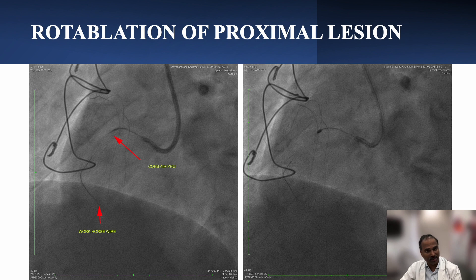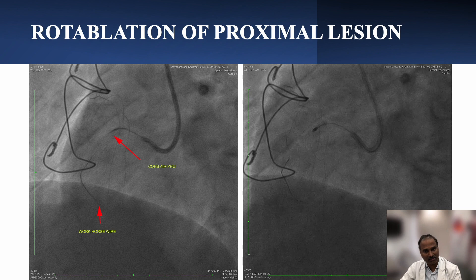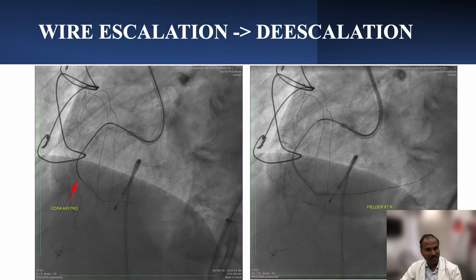We decided to go ahead with ablation of this lesion — a sequential ablation approach: first ablate the proximal lesion with the wire proximal to the distal lesion to create space, then chase the second lesion. Rotablation with 1.5 mm burr was performed — you can see we ablated this calcium nodule. After adequate ablation we came out, advanced Corsair further down, escalated again to UB3 then de-escalated to Fielder XTR, and crossed the lesion, sending the wire into the distal RCA.